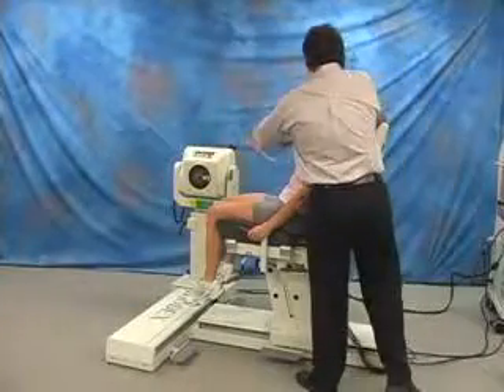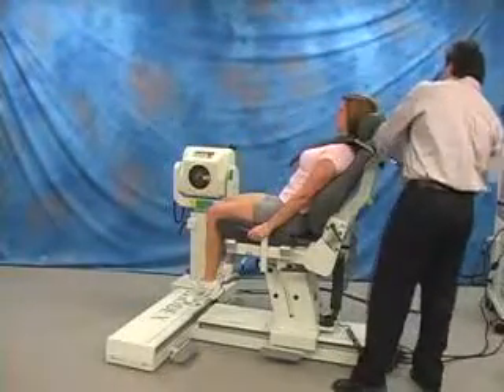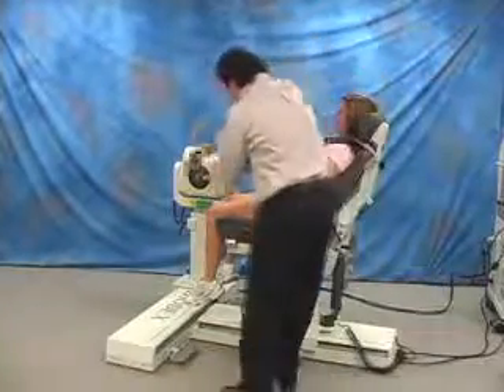Always remember to set the attachment up on the right side. Position seat back and stabilize patient with chair straps.